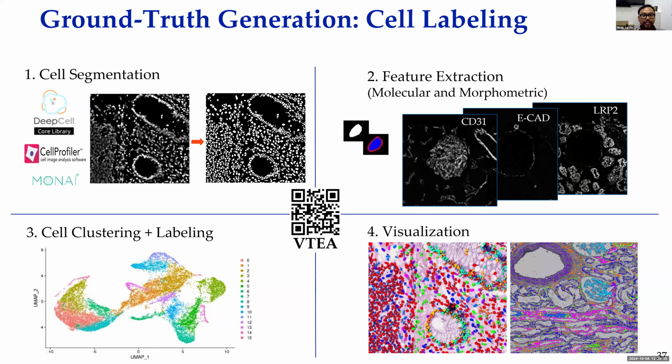For ground truth generation in this kind of project, we need cell segmentation. Cell segmentation means DAPI segmentation, which is at the bottom of this kind of task and is very fundamental. We have seen so many cell segmentation algorithms. We have our own algorithm, and this part has to be correct to segment DAPI from a whole slide image in a systematic, generalized way.